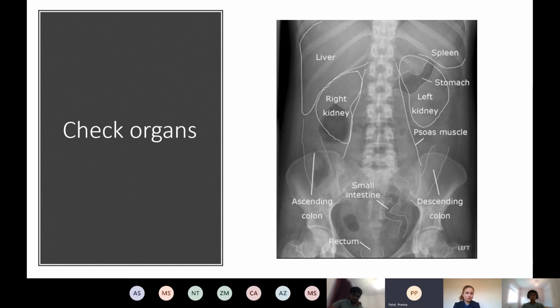So I go stomach, small bowel, large bowel, rectum. And then I go top to bottom again with non-bowel. So I go kidneys, liver, spleen, pancreas, and gallbladder. Sometimes you can see them. And then the spine and pelvic area. So it doesn't really matter how you do it, just have a system so you don't ever forget anything.